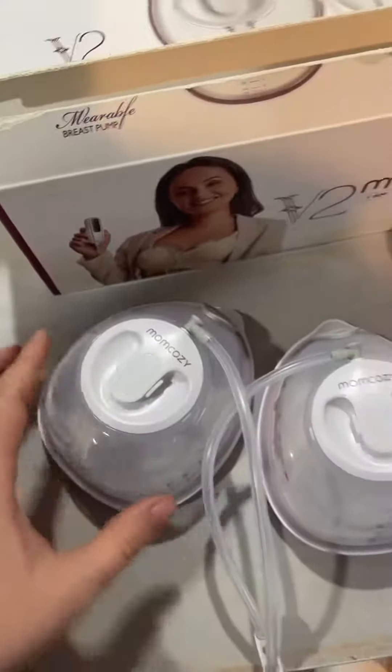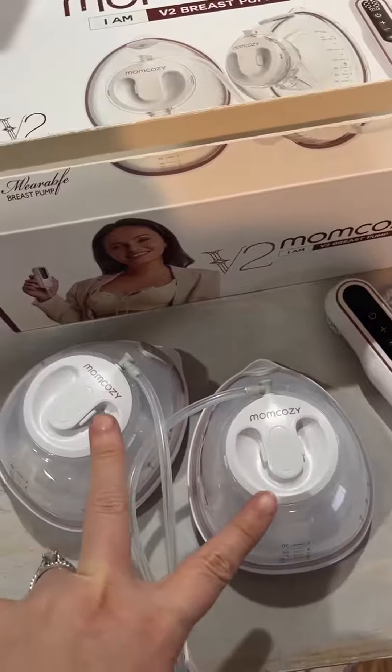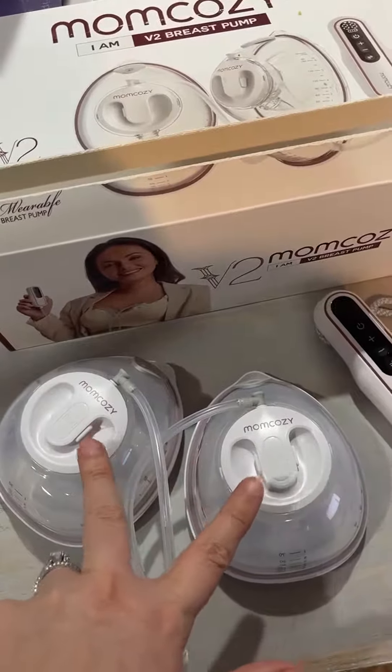These are the working parts. You actually get two of the pumps — one for the right and one for the left. They can actually be swapped as well, so you don't necessarily have to use these on a specific side.